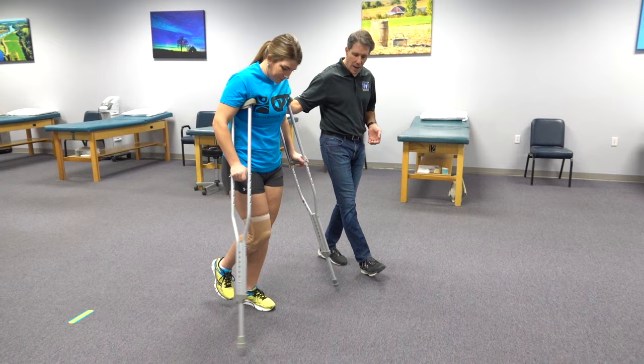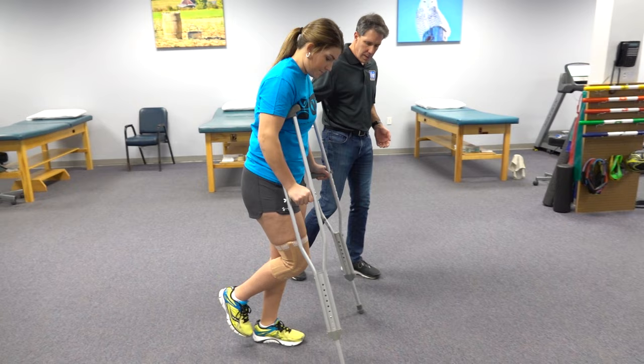See how the foot comes through past the crutches. And when you turn, you make a nice big turn, so come right around this way.